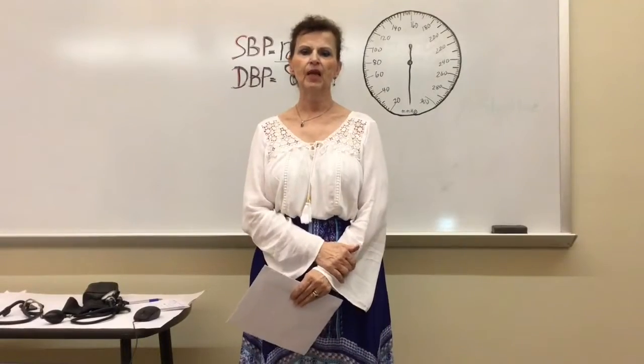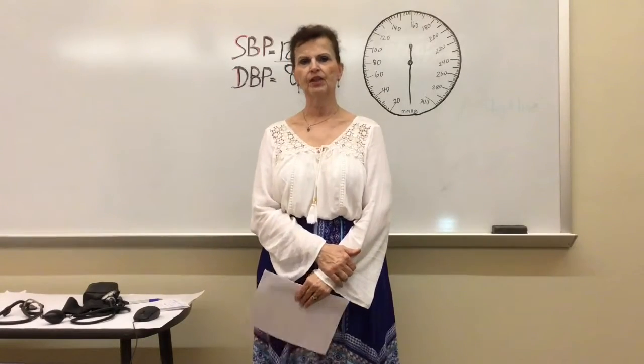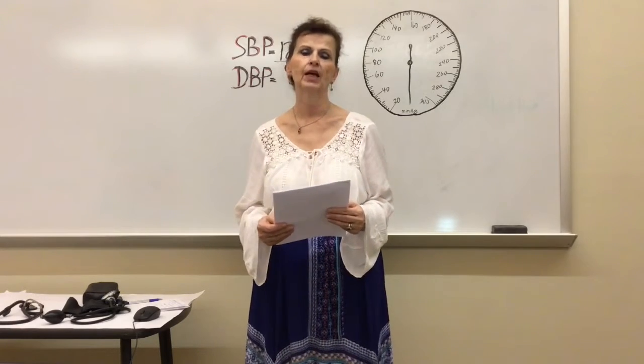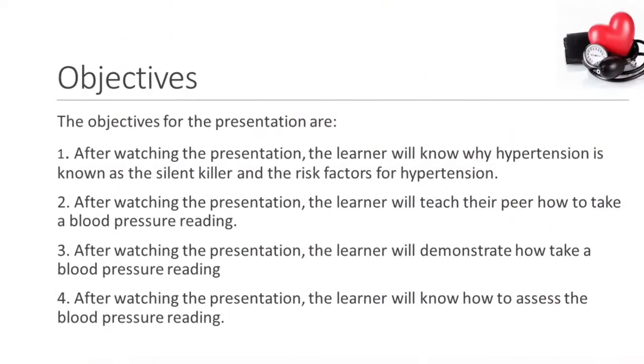Hello, my name is Ivana Blackledge, and this presentation is how to take a correct blood pressure measurement. I will start with an introduction on hypertension in order for you to know how critical it is to take an accurate blood pressure reading.